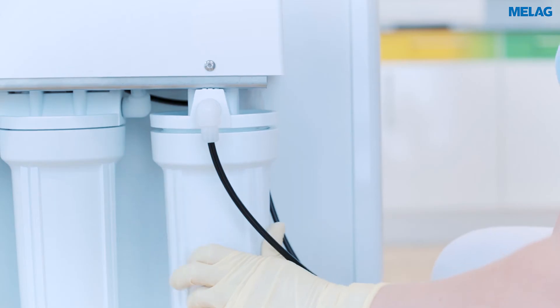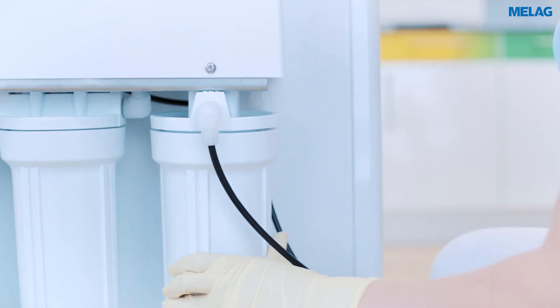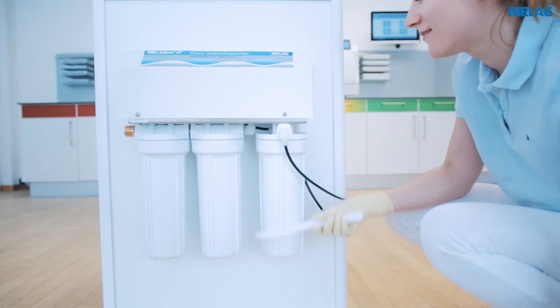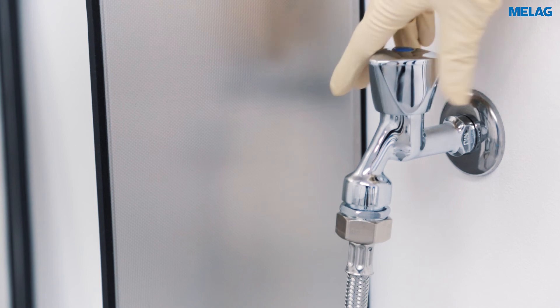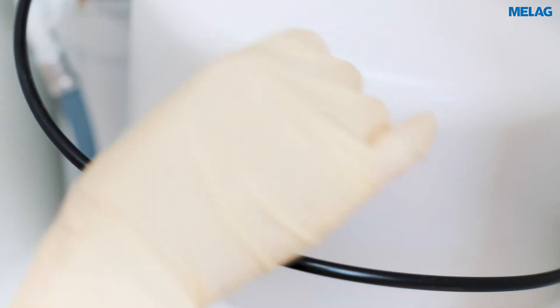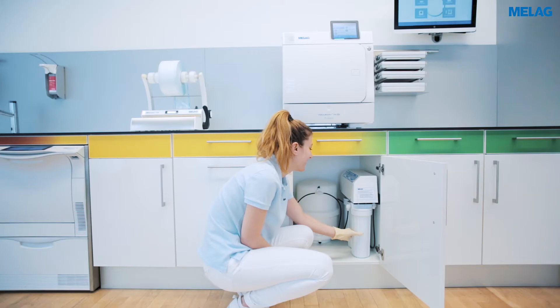Please tighten the container by hand and then with the wrench. After you have reopened the water tap as well as the shutoff valve and have checked the Meladem 47 for leaks, your steam sterilizer and water treatment unit are ready for use.